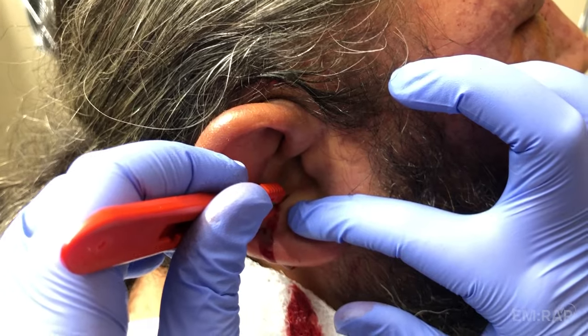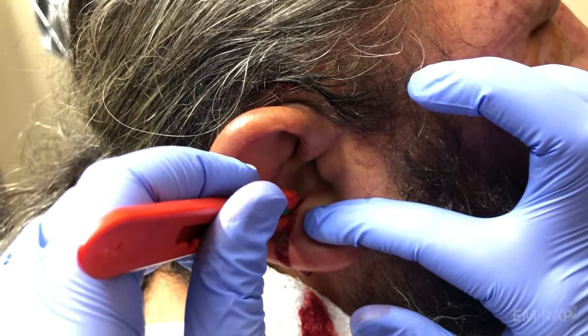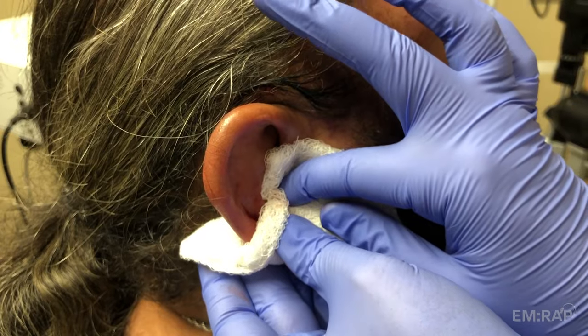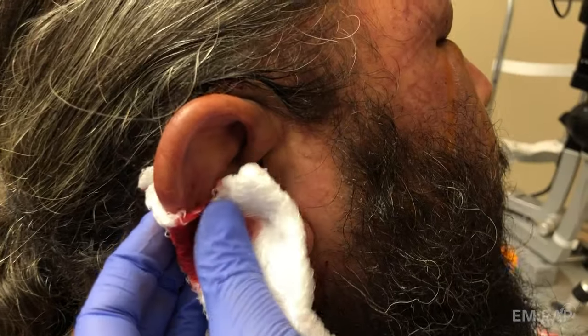We're doing a second incision. This one goes just inside the anti-helix, following that anatomic fold. Same steps here: gently deloculate, you can irrigate, and then use compression to remove the blood. Flatten that ear back down to its normal shape.